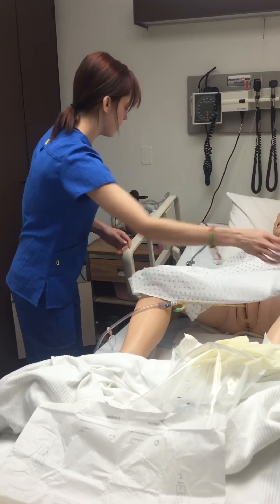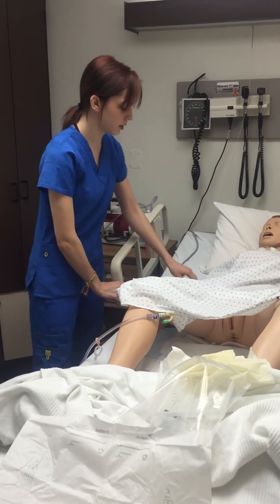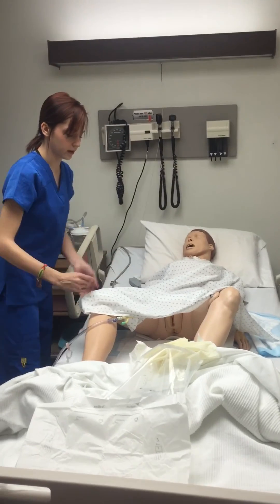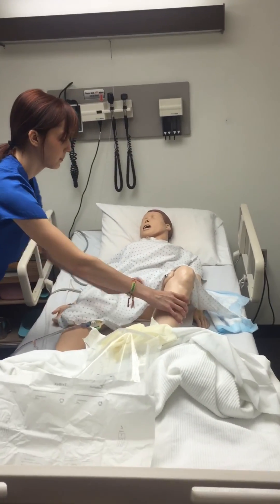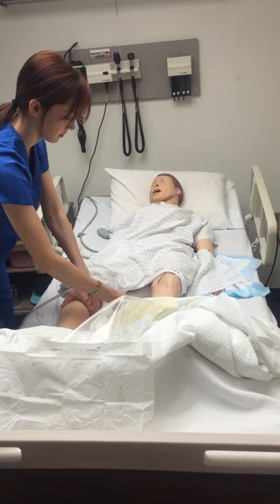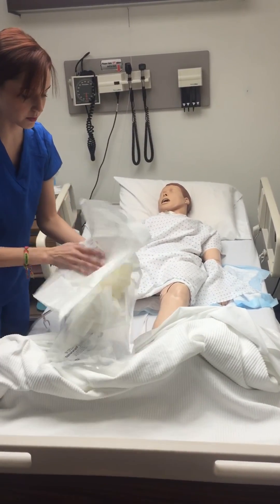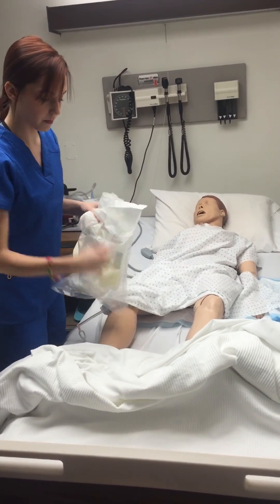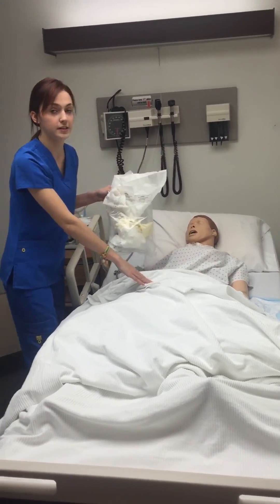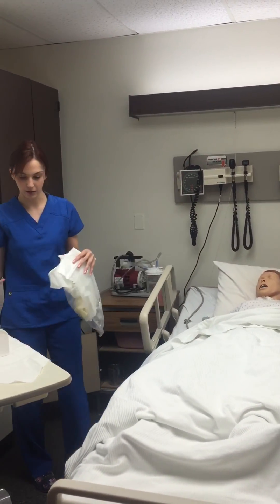And then I would lower the bed and clean this up and cover her back up. Then I will provide her with her call light and make sure she's comfortable. I would remove this as well and discard all my garbage. I would make sure her stomach isn't feeling tender and check if she has any discomfort.